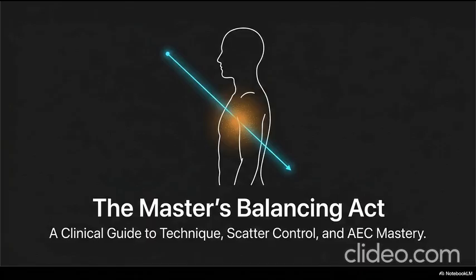Okay, so let's say we've done all that math perfectly. We've set our mAs to get the right quantity, calibrated the kVp to penetrate the tissue without washing out the contrast, and measured our distance down to the literal inch. Okay, perfect setup. We fire the beam. But the moment that perfectly calibrated primary beam enters the human body, the real chaos starts. The invisible enemy. Yes. It encounters the invisible enemy of radiography: scatter.